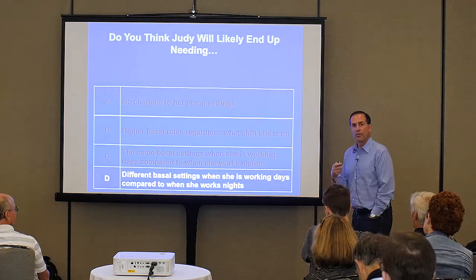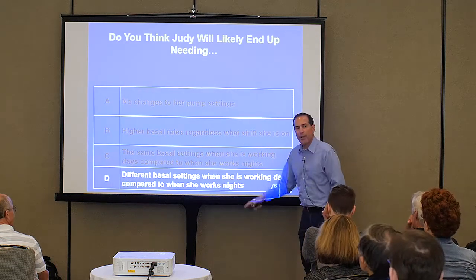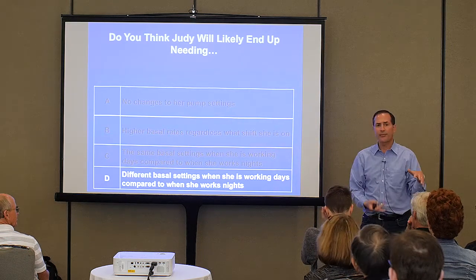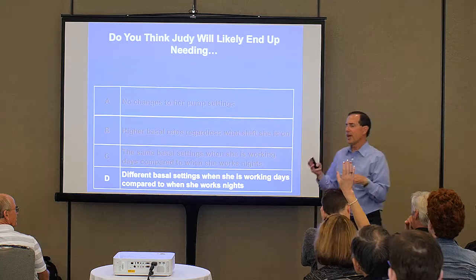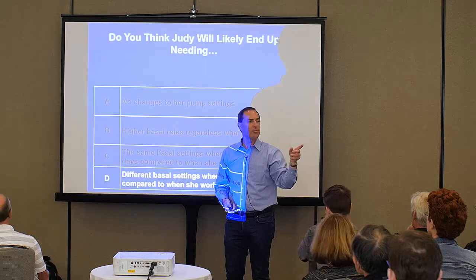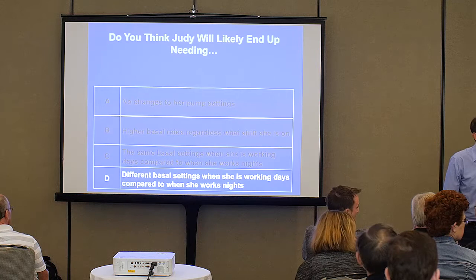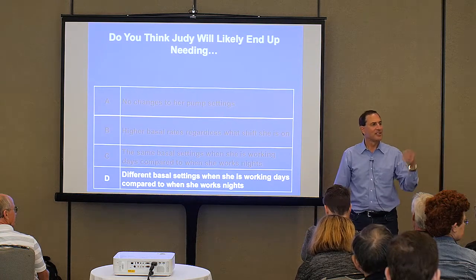So one thing which I recommended to her is that we pre-program her pump with two different sets of basal rates. And I find hardly anybody does that. Who here has two different sets of basal rates? You know, one midnight, this and that, and a whole other second set. Okay, you do, and you do. So why do you? Why did you do that? I actually have three. I have an off day, I have a work day, and I have a work weekend day, which is lovely.